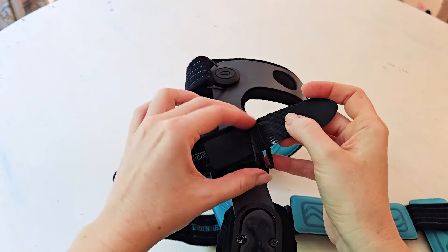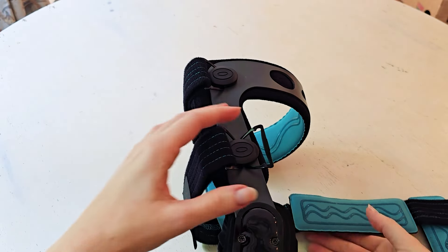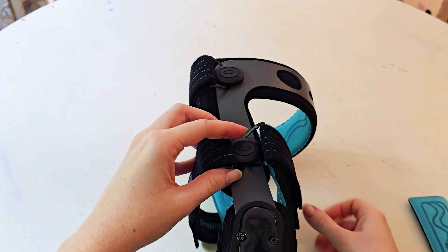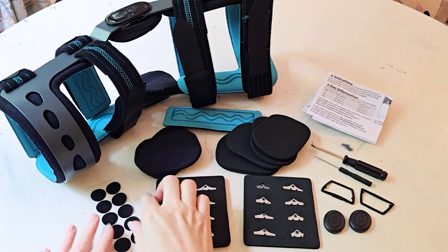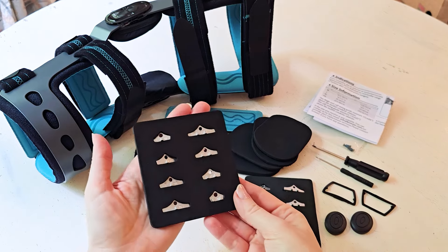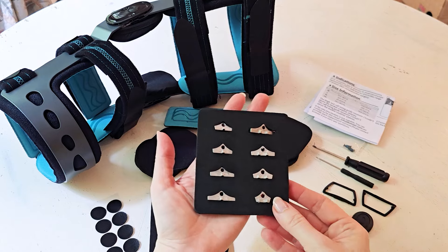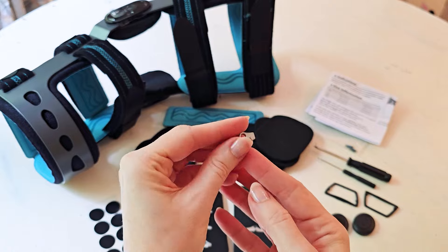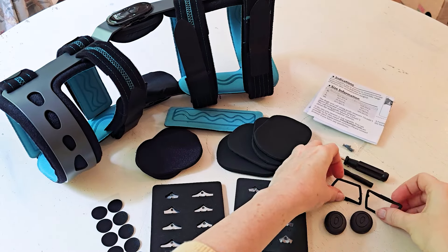The straps themselves are very long — not so long that they'd be cumbersome, but long enough to customize to whatever your leg size is, making it smaller or longer as needed. This foam piece is fixed and nicely cushioned. You really get a lot of pieces in the box — they've done a great job including everything you'd need to adjust or change along the sides.